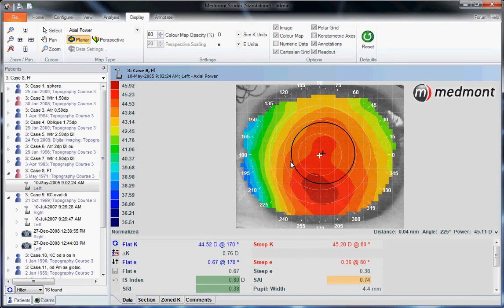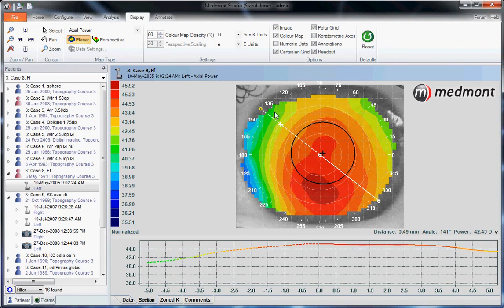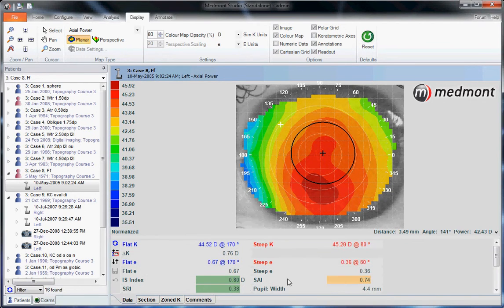The SAI, or surface asymmetry index, looks at the oblique meridians and compares powers across one hemichord versus the opposing hemichord — essentially asking: is one side of the line a mirror of the other? The more asymmetric, the higher the SAI value. A value greater than 1.0 is indicative of an abnormal eye. The last value, surface regularity index (SRI), looks at the powers distributed within the pupil — how smooth is the cornea? Any value under 0.8 is considered normal; in this case it is 0.38. Anything over 0.8 is considered abnormal.